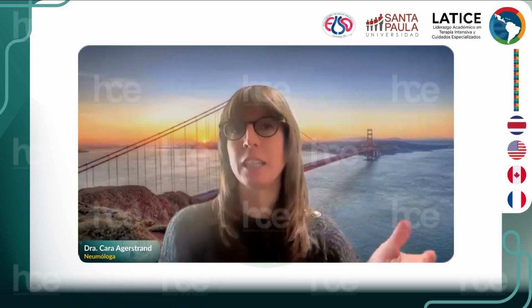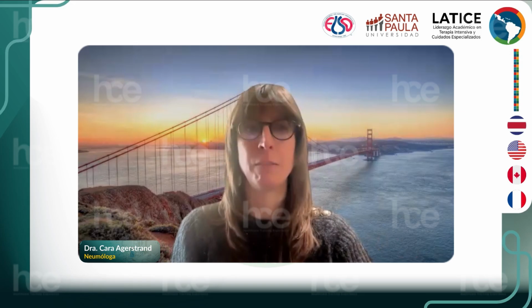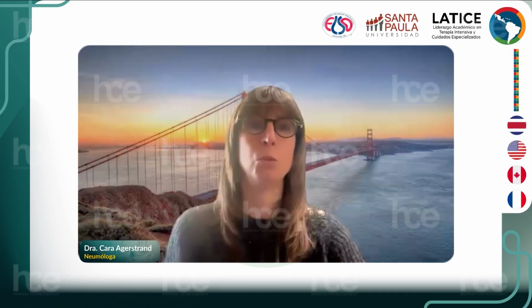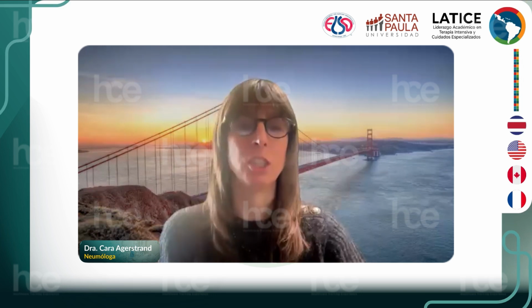How often do you have to run ECMO without anticoagulation? There's also a question about which anticoagulant you normally use and what your protocol is, but is it also common that you run it without anticoagulation? We're pretty liberal about stopping anticoagulation in patients who have any bleeding complication or thrombocytopenia. In our VV patients, we really don't think too much about it, frankly, because we've seen very good outcomes, very few occurrences of circuit clotting where the ECMO circuit needs to be changed, and people can do quite well.